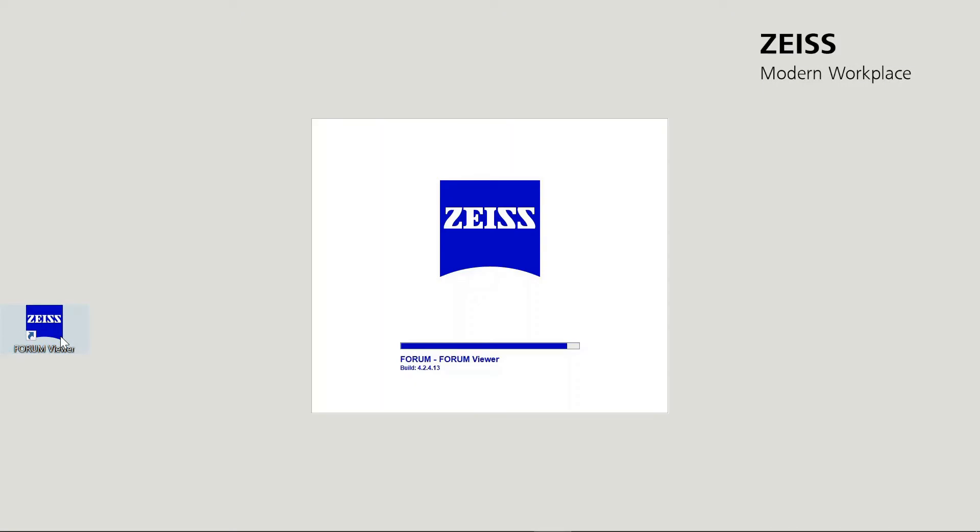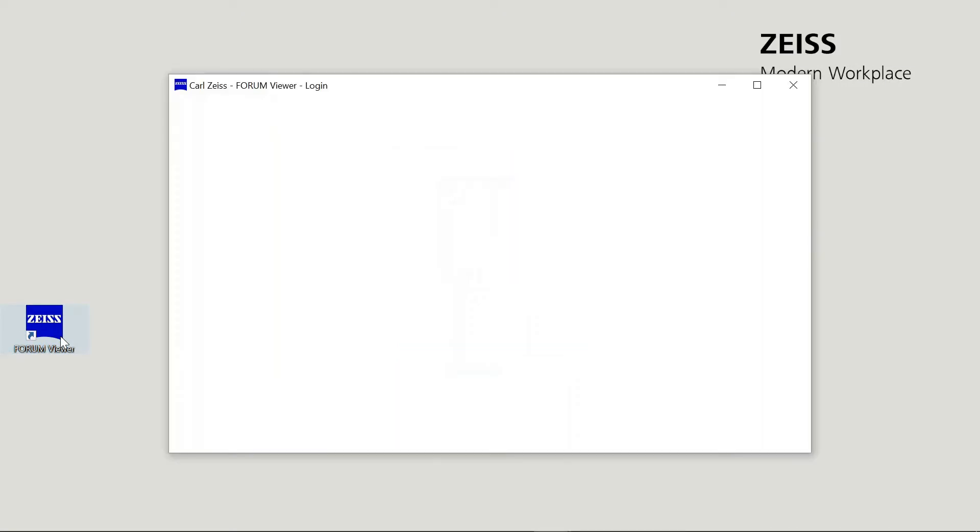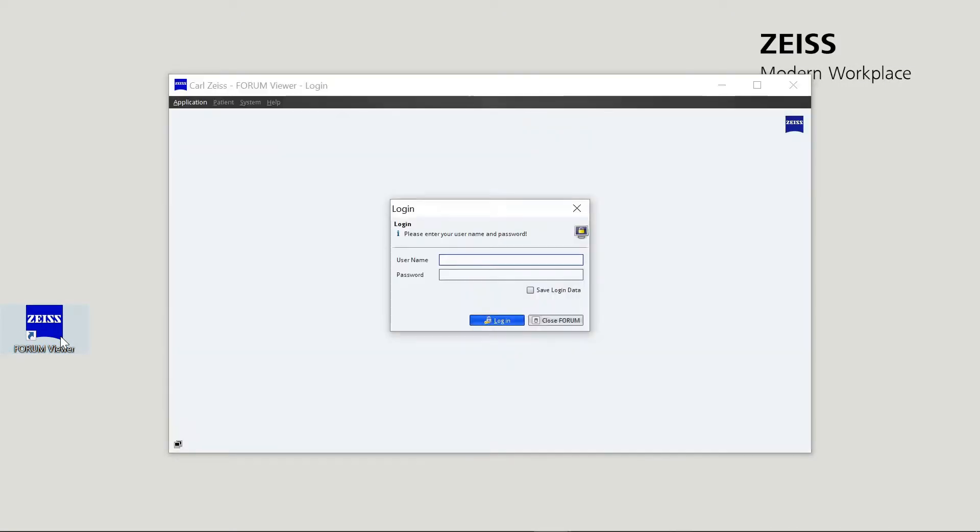Let's begin by opening the Zeiss EQ Workplace plugin on Zeiss Forum. Enter your username and password to login to Zeiss Forum viewer.